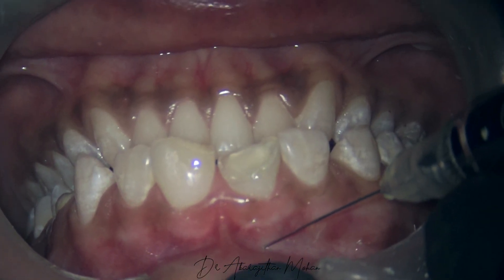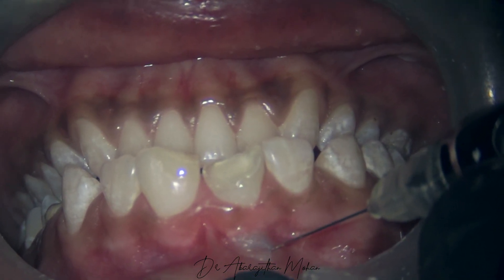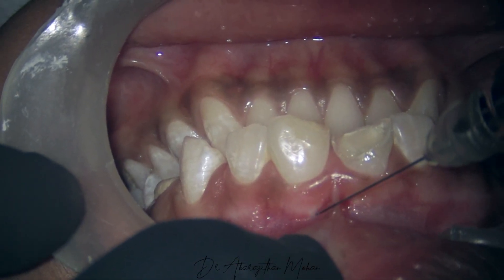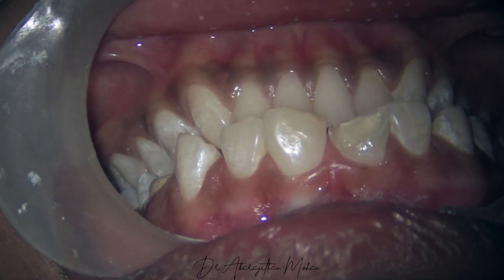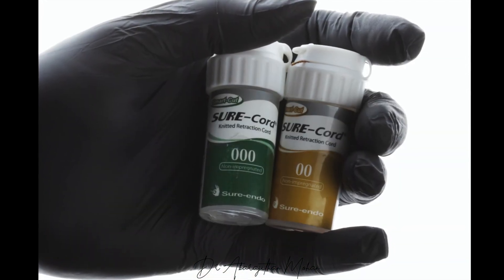After applying some topical anesthetic, I'm just infiltrating a few drops of Articaine here, and then we are going to proceed with the cord placement.